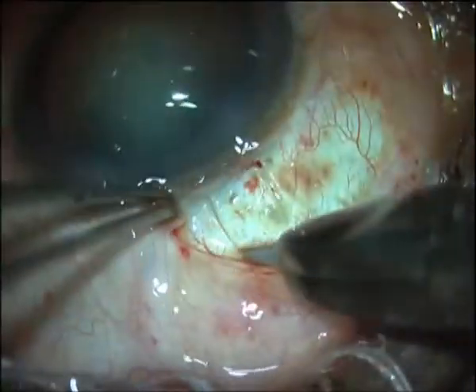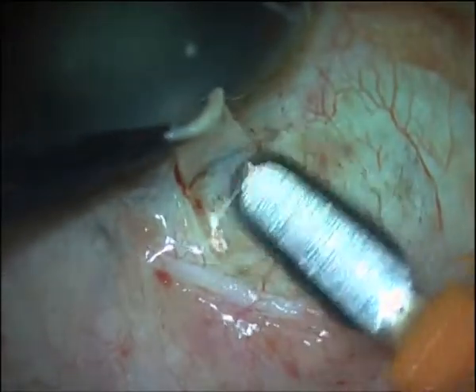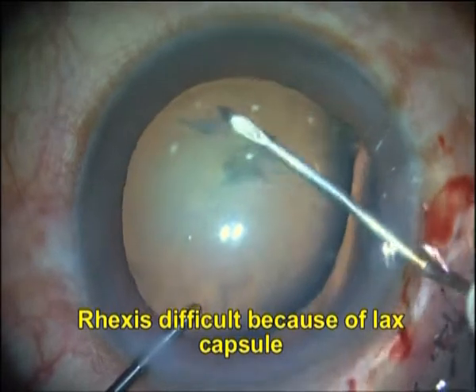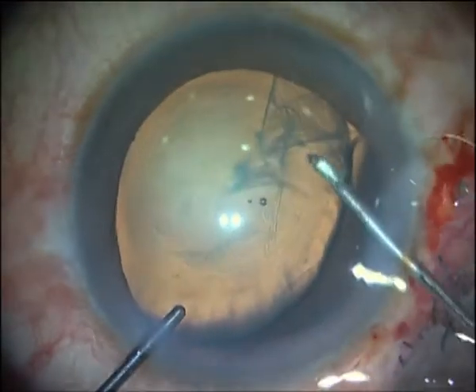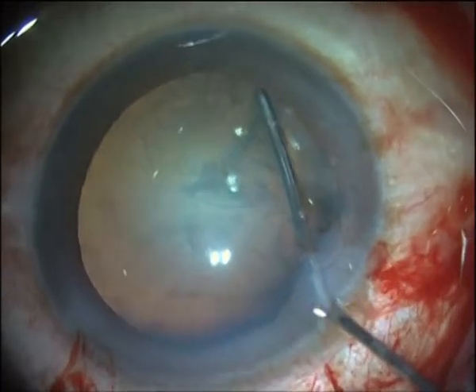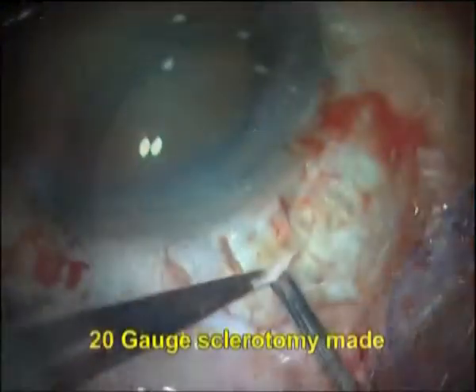A partial thickness scleral flap is made, centered on the area of missing or weak zonules. A capsulorexis is created, taking care to avoid making it unduly large or small or extending too much to the periphery. Excessive traction on the zonules should be avoided. A gentle capsule-cleaving hydro-dissection is performed, taking care not to churn the cortex.